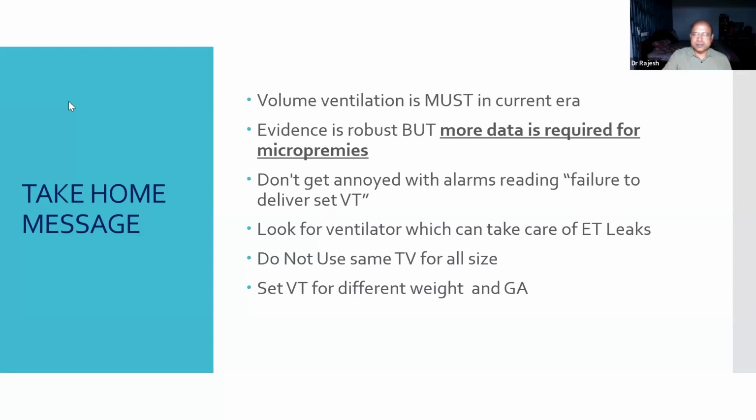Nowadays in the market, cuffed ET tubes are available for neonates. Should I use that? I will not advise it at this stage.